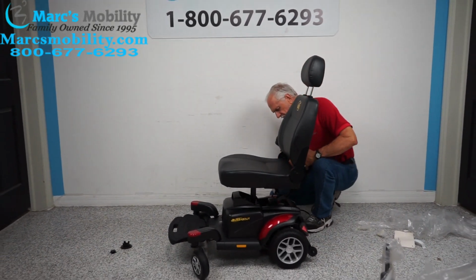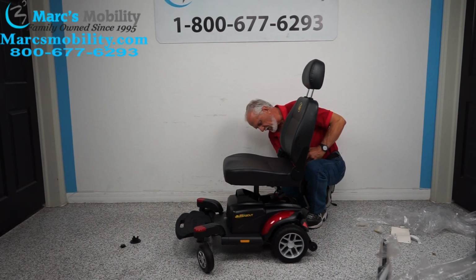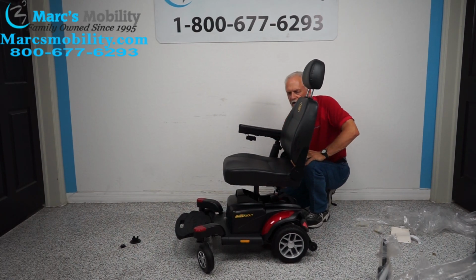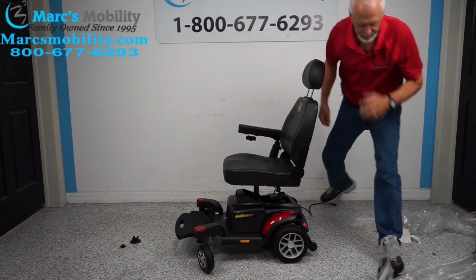And when you put the arms in, there's little screws under the seat. You need to unscrew them because the arms won't go in until the screws are all the way unscrewed. You'll see on the other side when I put the other arm on.